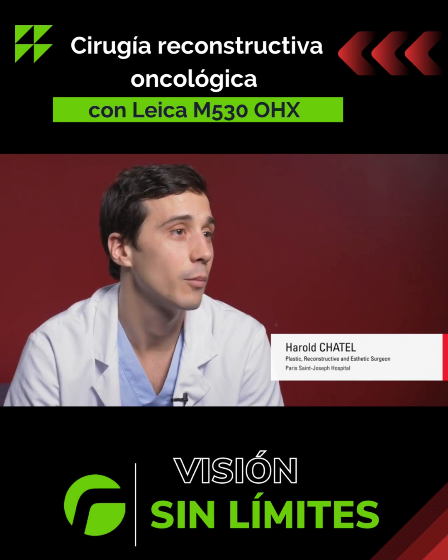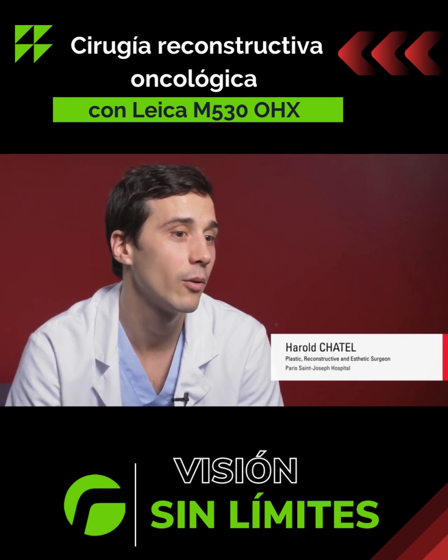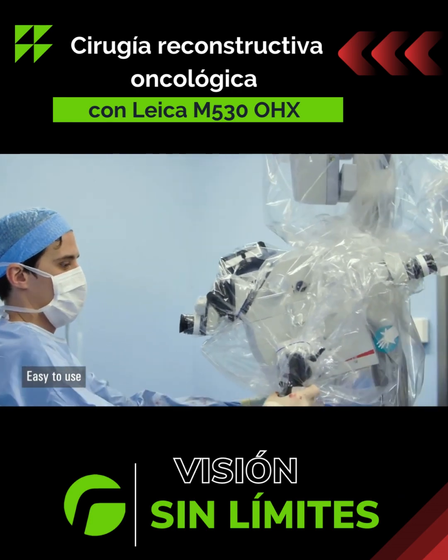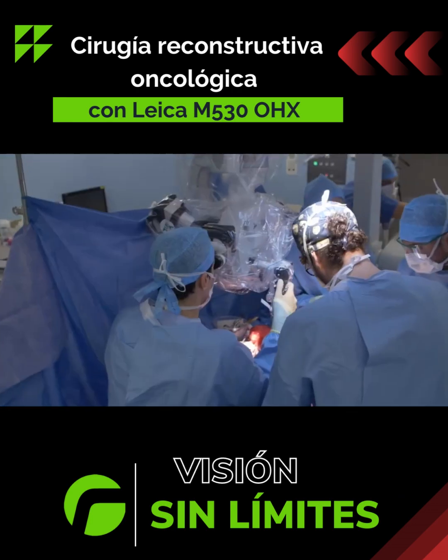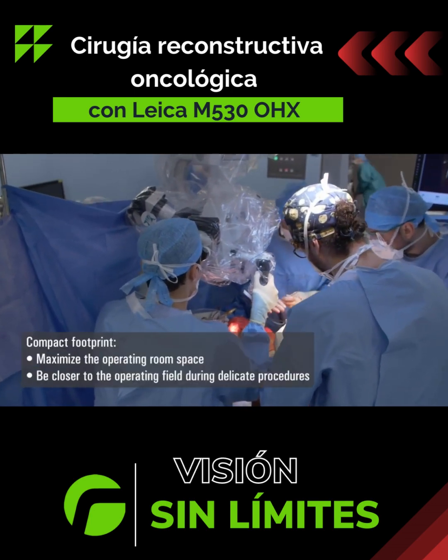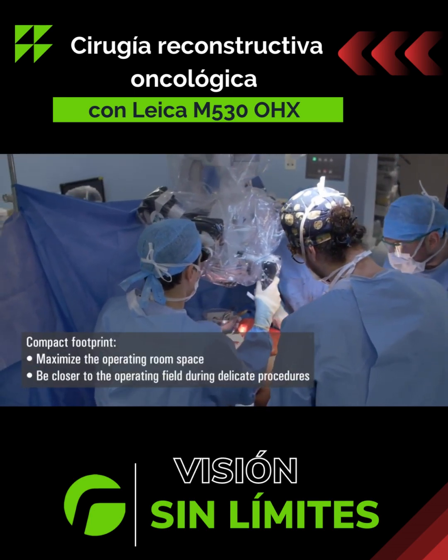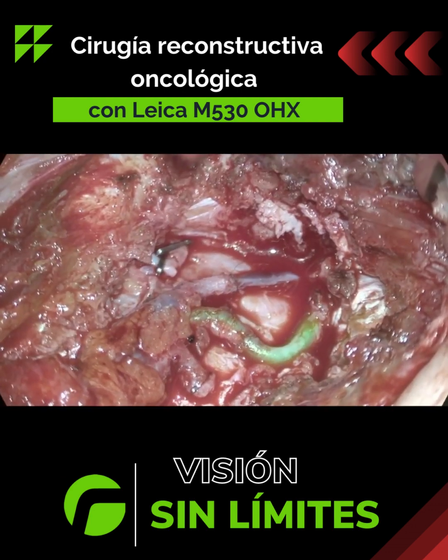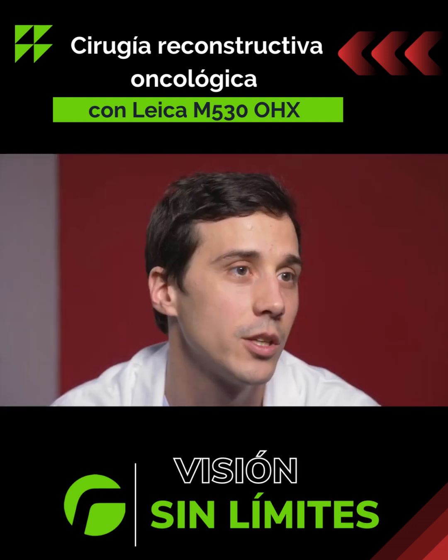The O-HX microscope in itself is a jewel of technology. It's really easy to use, easier than microscopes I've had to use before. It's more ergonomic, especially when you have a space problem in the operating room. Its use is really seamless and very easy, and the GLO 800 advantages are really substantial.